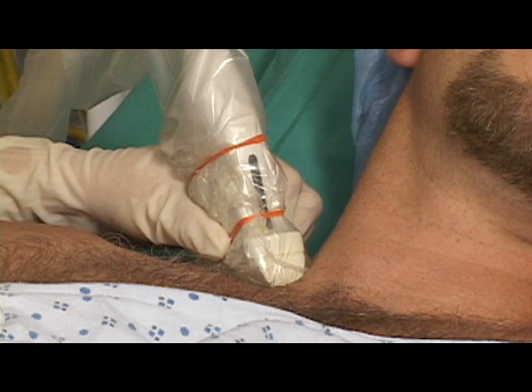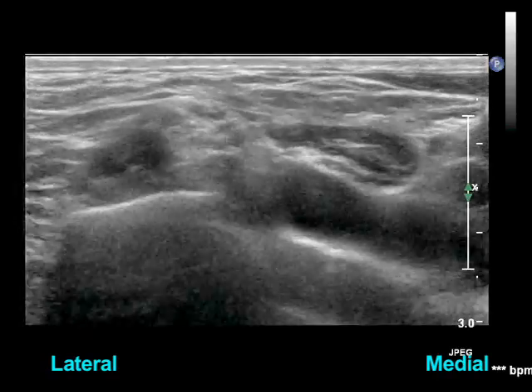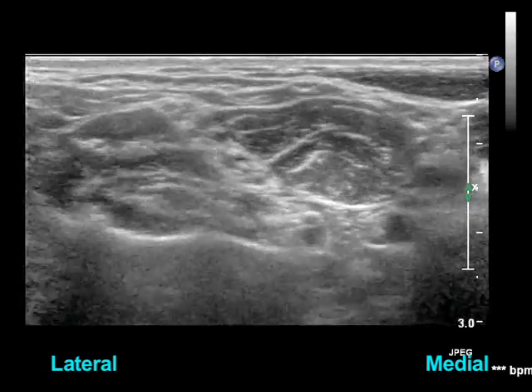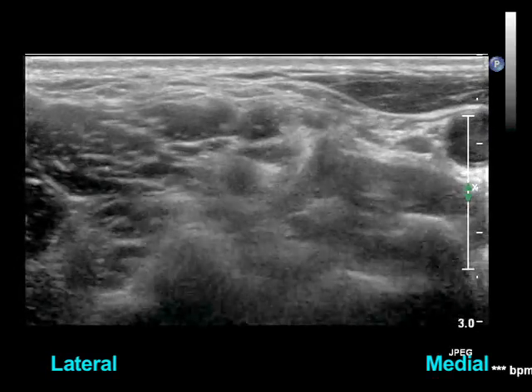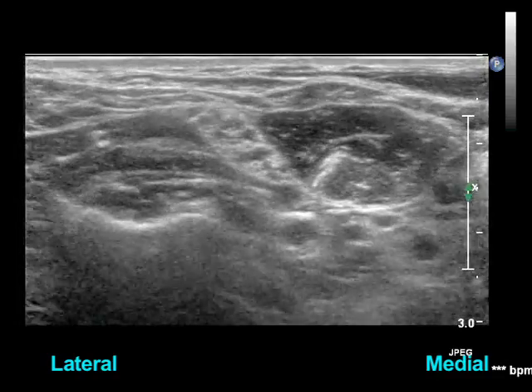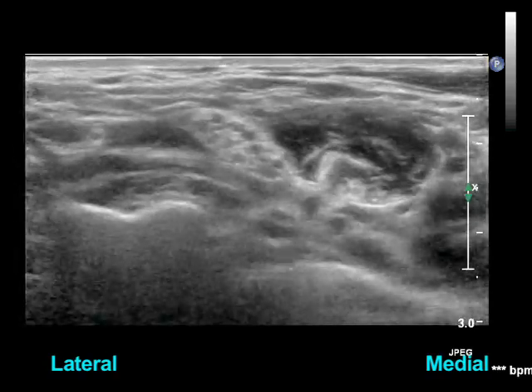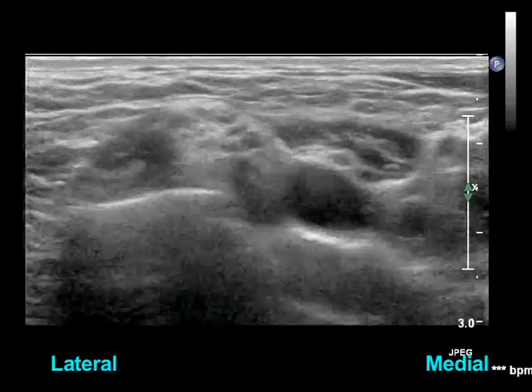The transducer slides to obtain the optimal image of the brachial plexus. This corresponding video illustrates the transition between supraclavicular imaging and interscalene imaging. In the supraclavicular region, the brachial plexus joins the lateral side of the subclavian artery at the first rib — it is here where the brachial plexus is most compact. When the transducer slides cephalad, the brachial plexus can be followed in short-axis view between the anterior and middle scalene muscles.